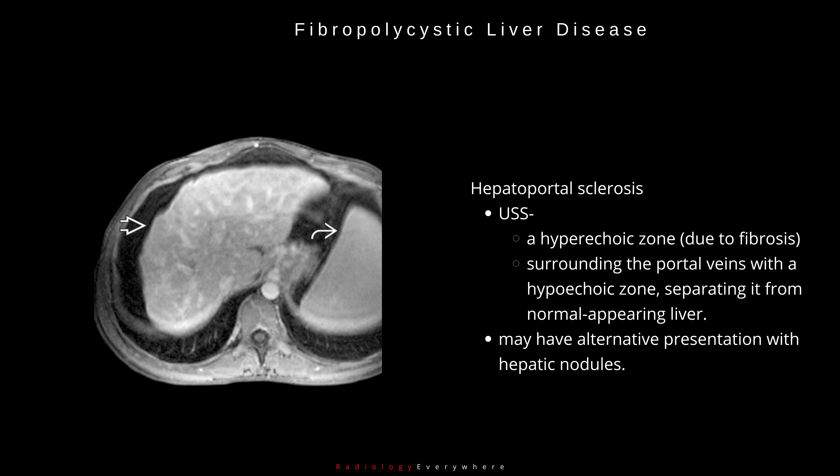In hepatoportal sclerosis, ultrasound may show a hyperechoic zone representing fibrosis surrounding the portal veins, with a hypoechoic zone separating it from the normal-appearing liver. This entity may have an alternative presentation with hepatic nodules.